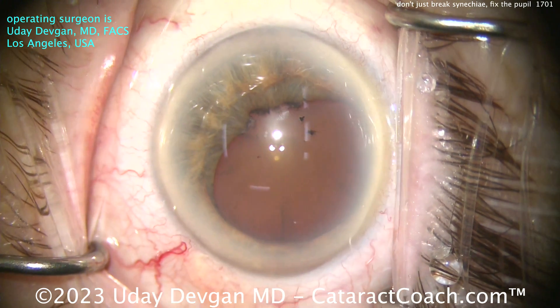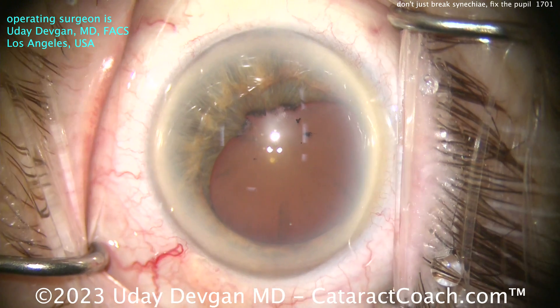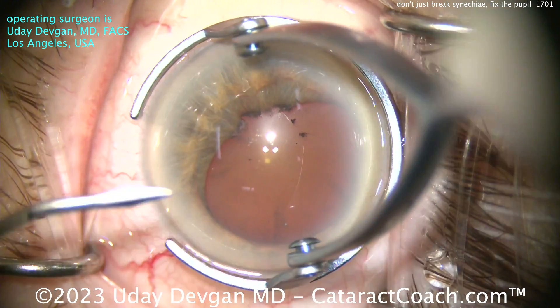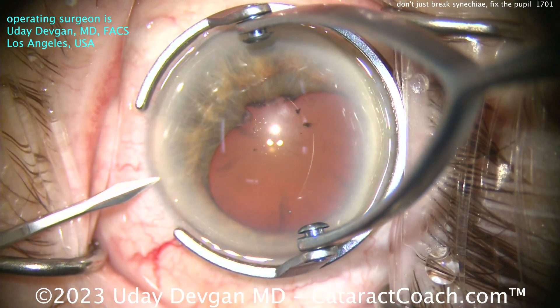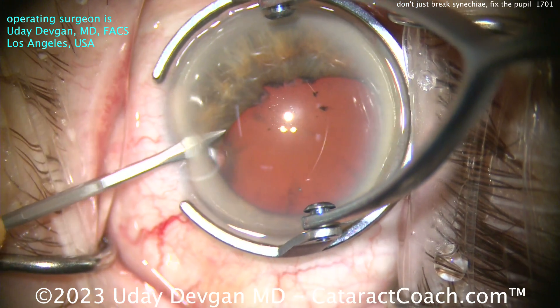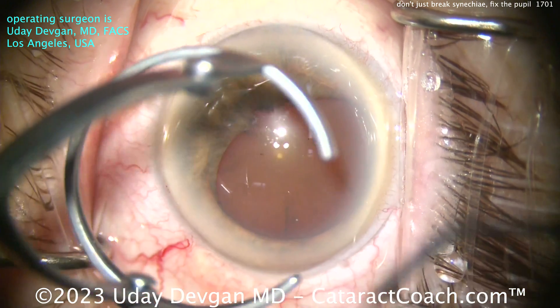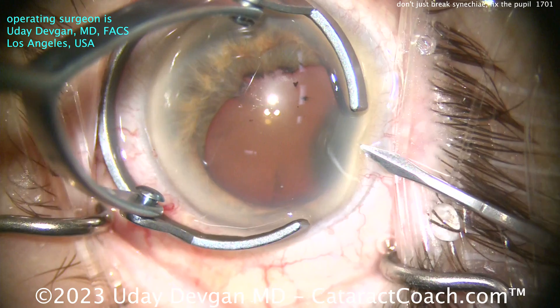So a patient with prior uveitis here for cataract surgery. You can see the extensive synechiae there that's gluing down that iris to the anterior lens capsule. But in addition to just the synechiae, there's actually a membrane there underneath that's really grown there, distorting the pupil and causing it to be glued down.